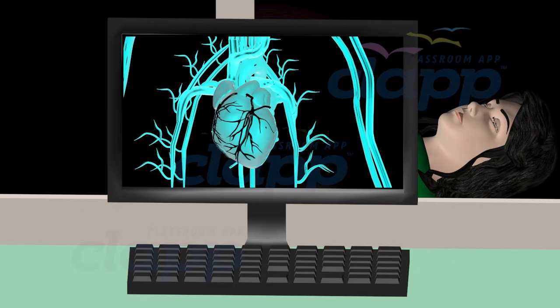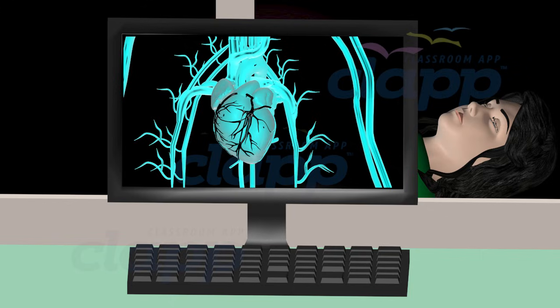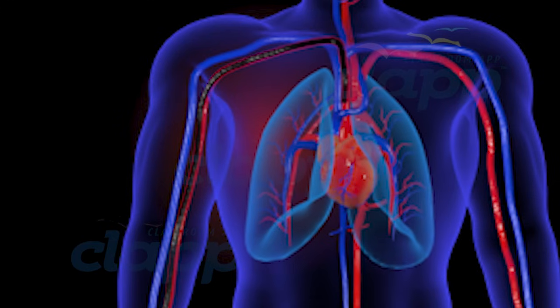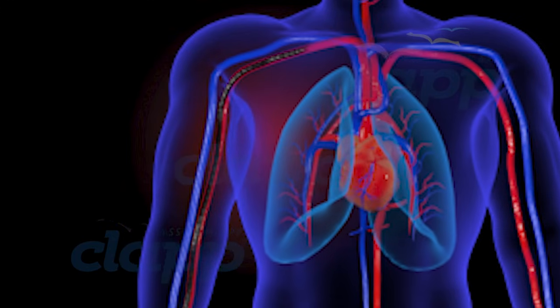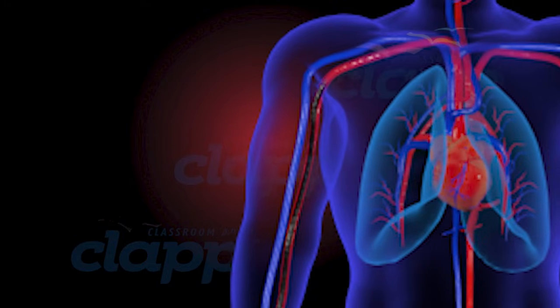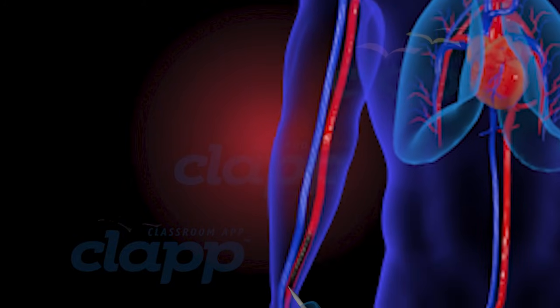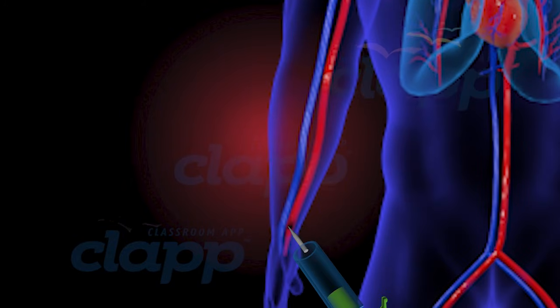X-ray images are taken as the dye moves through the blood vessels. These images help the doctor visualize any blockages, narrowing, or abnormalities in the blood vessels. After the necessary images are obtained, the catheter is removed, and pressure may be applied to the insertion site to prevent bleeding.